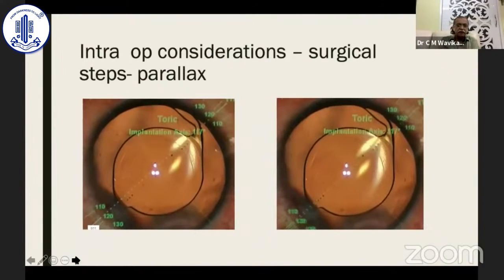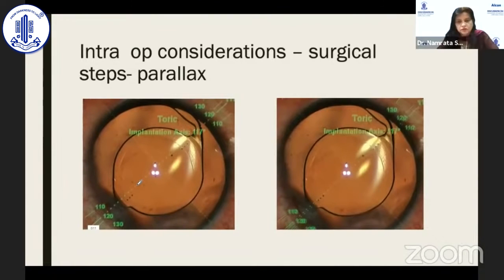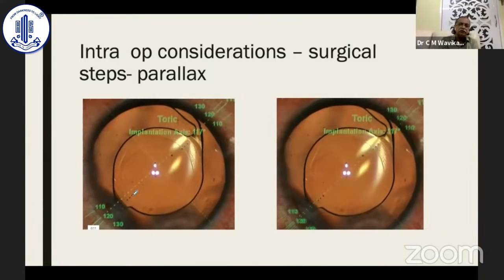One important point about parallax: the marker line and the three dots connecting the axis of the toric lens may appear parallel but not overlapping, or they may appear overlapping — both positions are correct. This situation occurs because of parallax, since the marker is on the corneal surface while the three dots are in the anterior chamber. As long as the line joining the three dots on either side of the lens is parallel to the marker, you are doing correctly.